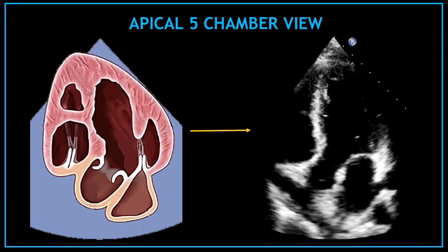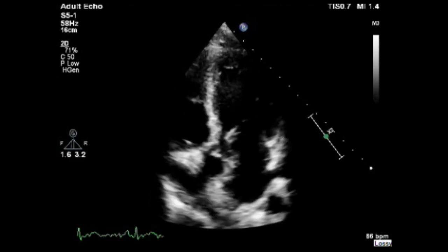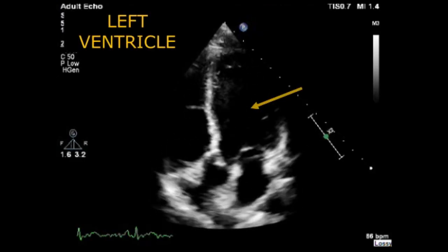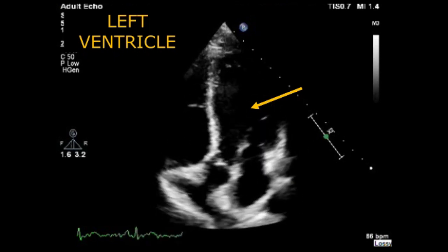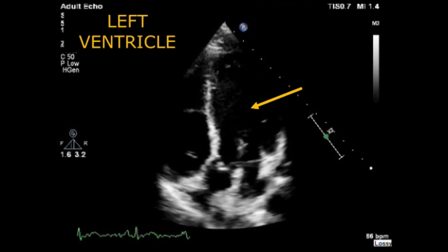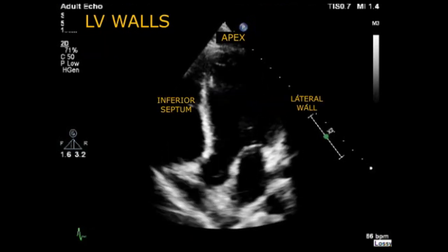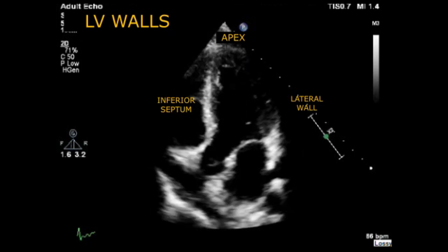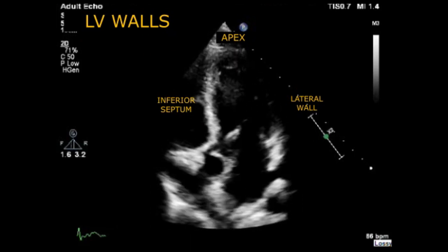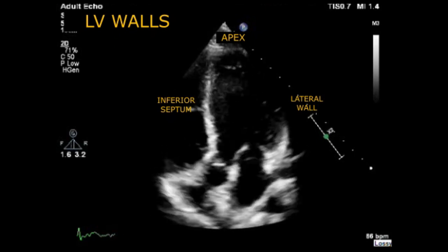Now I'm going to show you one by one on a video all the structures visualized in the apical 5 chamber view. First, in this view, we have the left ventricle and the walls visualized here are the inferior septum in the middle, the lateral wall on the right hand side, and the apex.